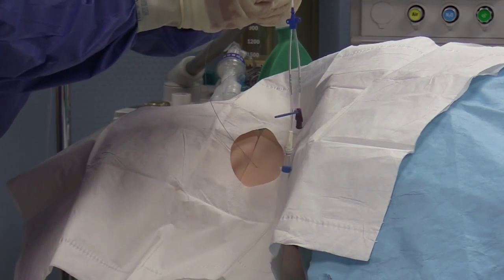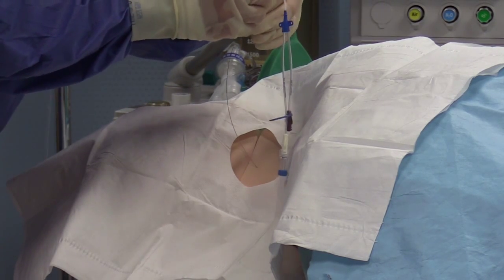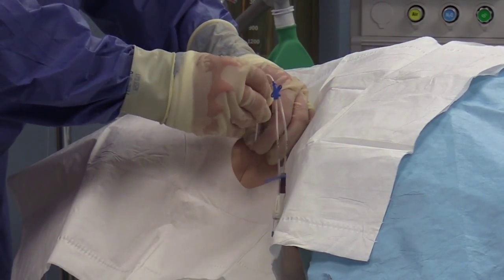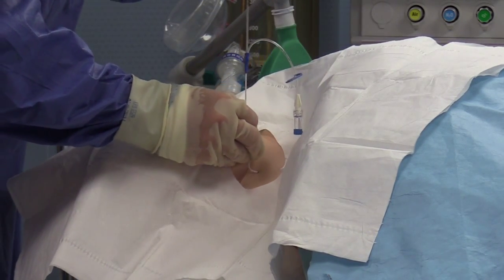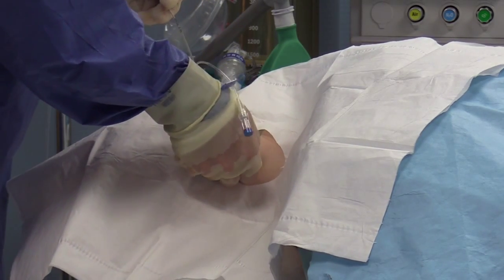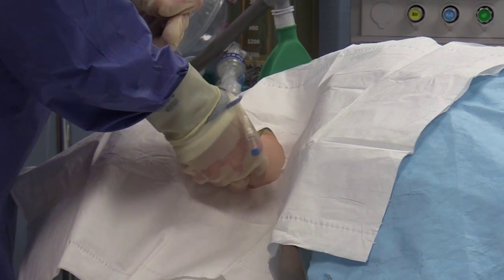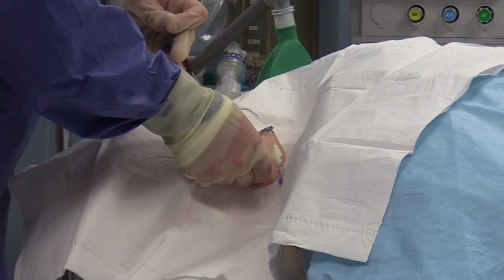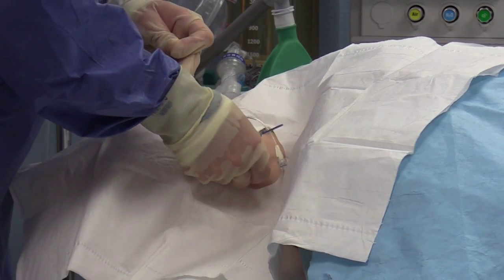Thread the catheter over the guide wire, holding onto the wire at the skin line, and slide the catheter into place, being sure to grasp the guide wire from above through the brown port as soon as it is available. Insert the catheter until it is flush with the skin line.